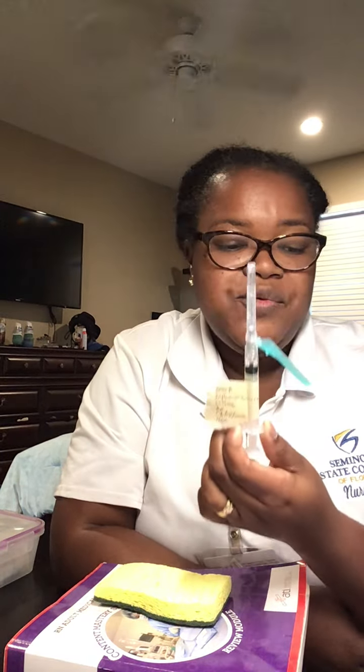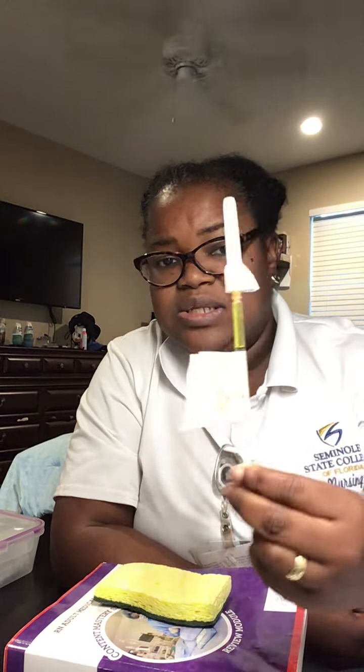But now, Miss Anna, I'm here to give you 2 injections. The one is intramuscular. This is for influenza, it is yearly. After I give it, if you feel any redness or swelling in the part where I put your injection, if you have fever or nausea, I'm going to watch closely what reaction you have. And also I'm going to give subcutaneously the vitamin 12, which you are going to have monthly.